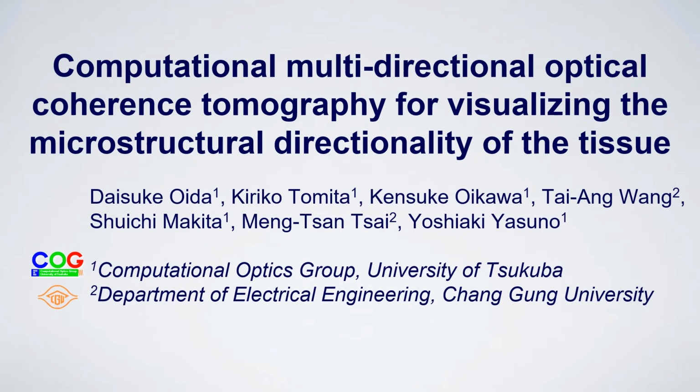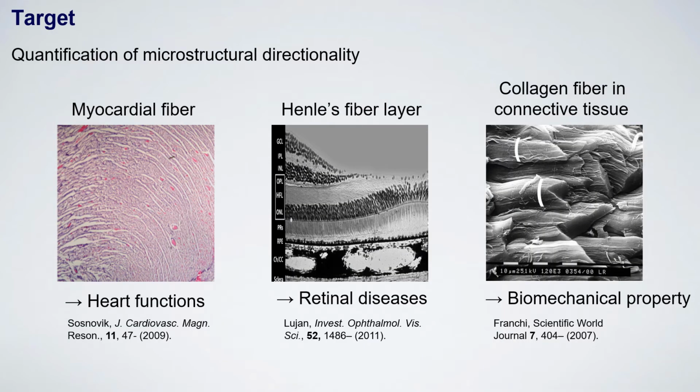Today I'm going to talk about computational multi-directional optical coherence tomography for visualizing the microstructural directionality of the tissue. The target of our research is quantification of microstructural directionality. The assessment of microstructural directionality is beneficial in some clinical fields.